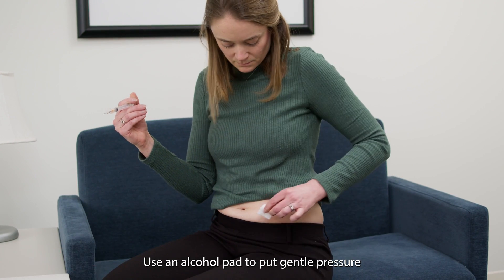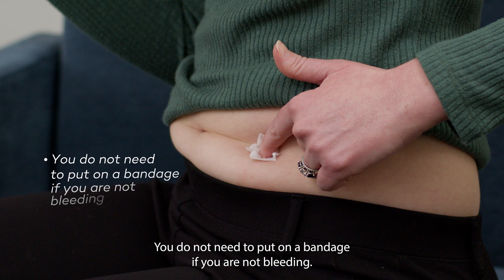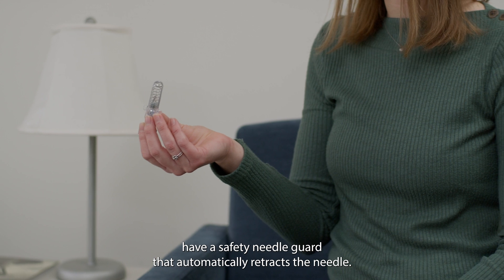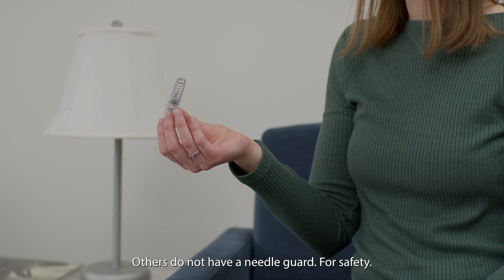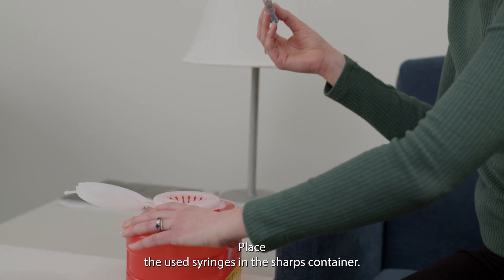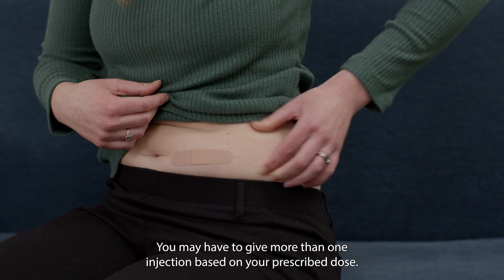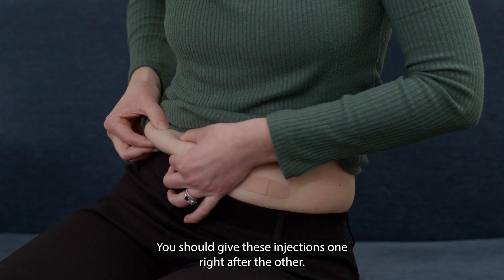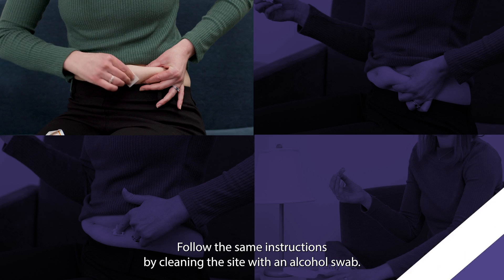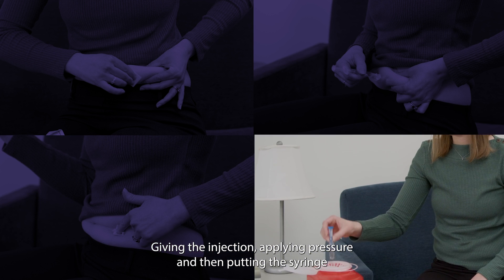Let go of the skin and pull the needle straight out. Use an alcohol pad to put gentle pressure on the area for about 5 to 10 seconds to help stop bleeding from the needle prick. You do not need to put on a bandage if you are not bleeding. When you are done giving the injection, some syringes have a safety needle guard that automatically retracts the needle; others do not. For safety, do not try to put the cap back on the needle. Place the used syringes in the sharps container — never put them right into the regular trash or recycling bin. If you need to give more than one injection, give them one right after the other using a different site at least one inch away. Follow the same steps: clean the site with an alcohol swab, give the injection, apply pressure, and put the syringe in the sharps container.